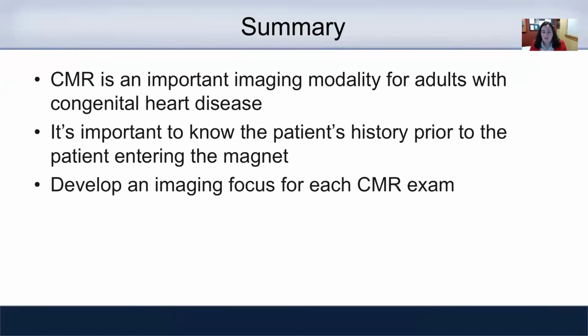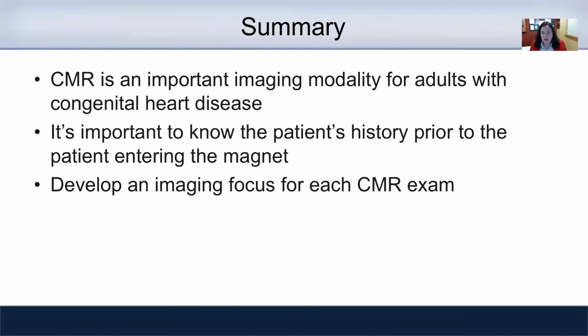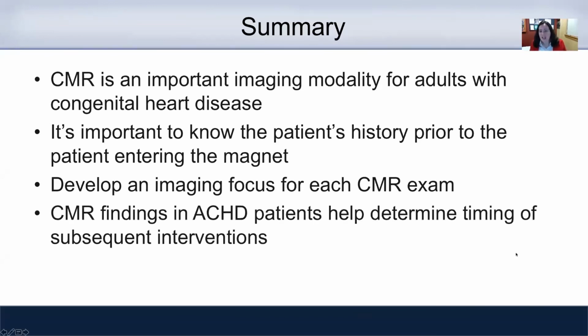So for that, I really do try to develop an imaging focus for each exam. You don't have to do every sequence every time, but by doing these sorts of exams, we're able to follow patients longitudinally and even help impact the timing of subsequent interventions.